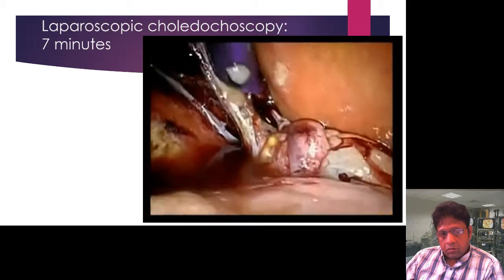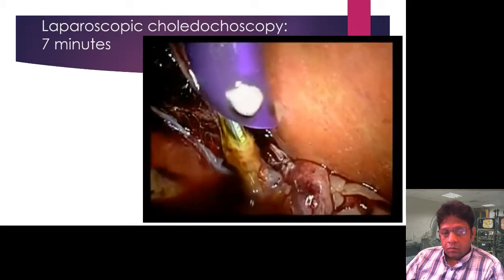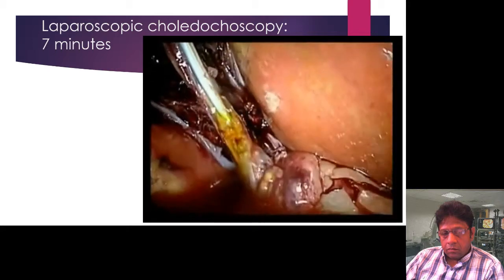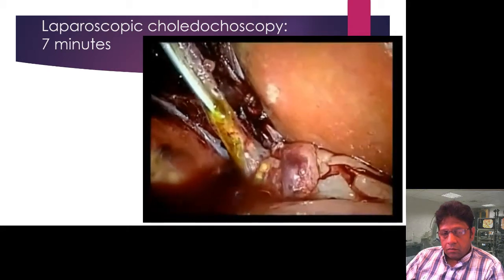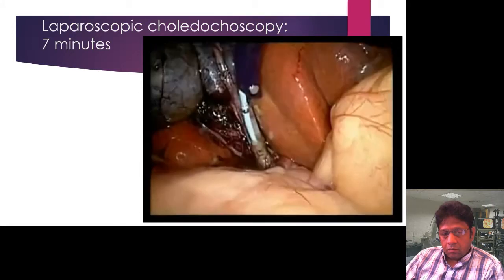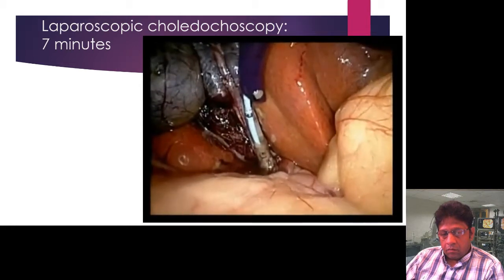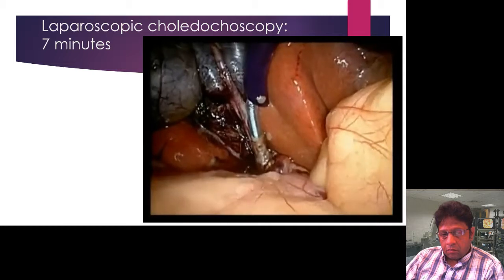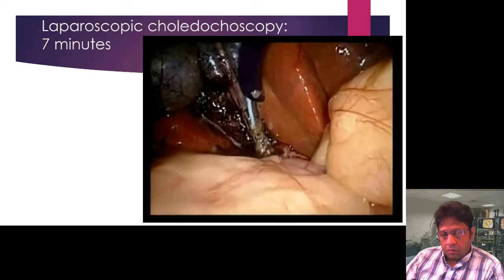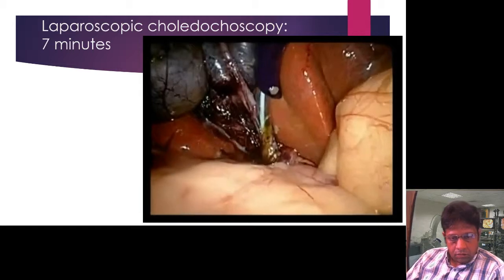The multiple instrument guide is used to guide a 0.035 glide wire inserted through a 10 centimeter by 12 French ureteral balloon dilation catheter. The catheter is carefully positioned in the cystic duct and inflated to 10 atmospheres pressure and held for 90 seconds. The balloon is deflated and the dilating catheter and glide wire are removed.